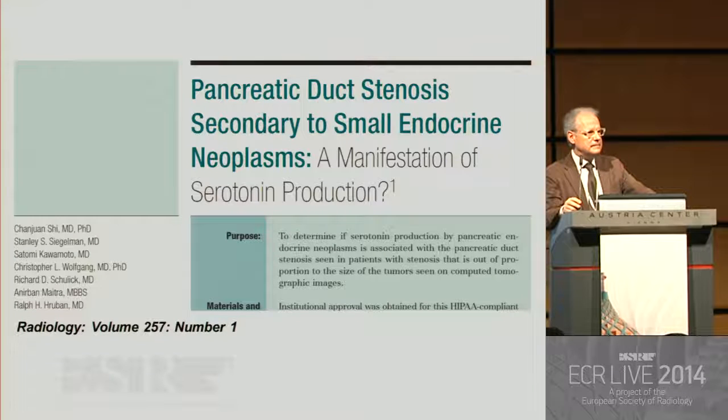In the case you just presented, there was a CT perfusion scan for the patient to see whether the tumor has some perfusion change during the therapy. So what do you think is the role of CT perfusion in those pancreatic endocrine tumors?